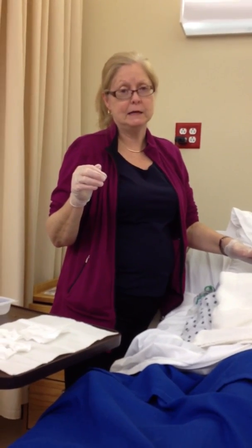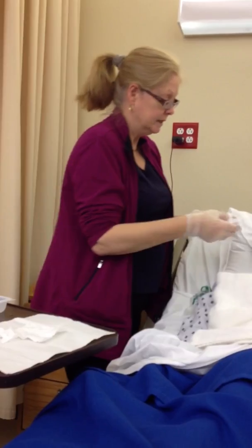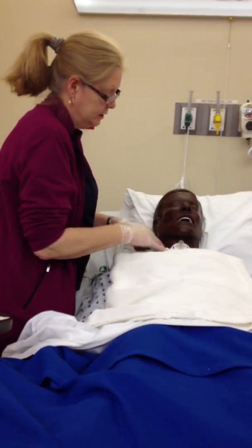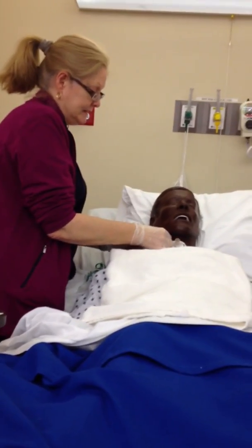So we've washed it, rinsed it, put the trach back in, the skin around the opening. We've washed it with 50% peroxide and normal saline. We've rinsed it with normal saline, and we've dried it. And so now I'm ready to put the gauze under here. And if you have a guy with a short neck, if you have hemostats, that would help. I didn't think about bringing my hemostats in here today.